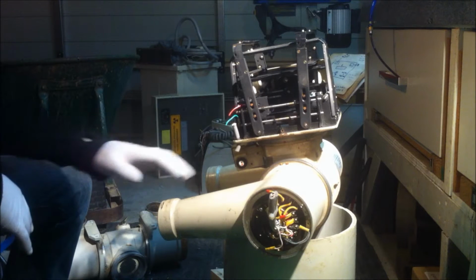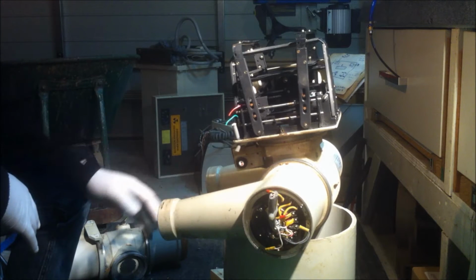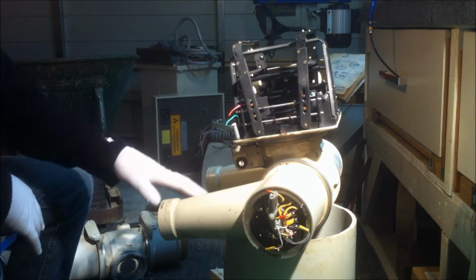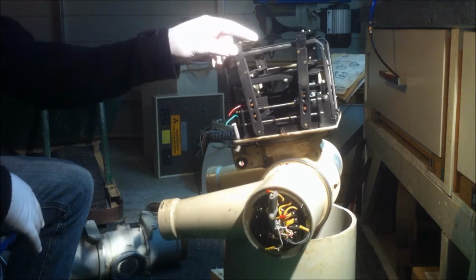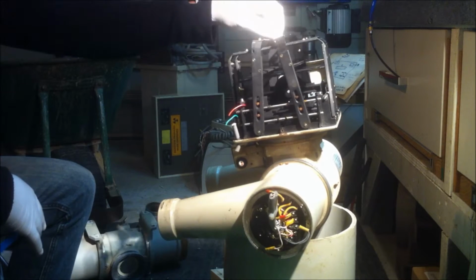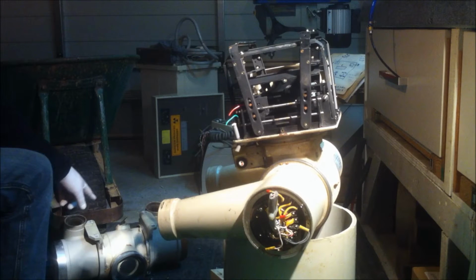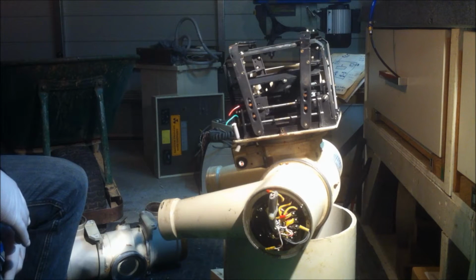Today I have a couple of x-ray heads that I'll be taking apart and salvaging as much as I can out of. We'll be keeping the federal connectors on the ends here and any other useful parts that there are inside. This little guy here still has the shutter assembly attached. Once we've taken this one apart, we'll move on to this larger one down here and take any useful parts out of that one as well.